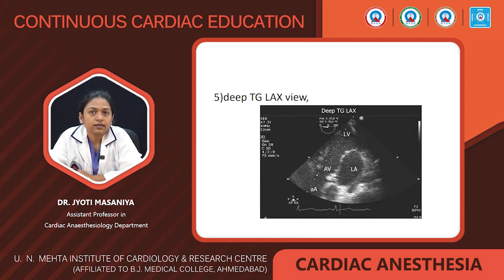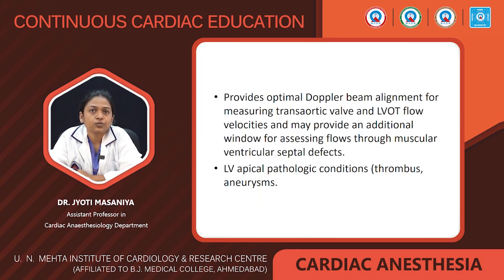The next view is the deep transgastric long-axis view. This view is obtained by advancing the probe deep into the stomach and anteflexing the tip to obtain the view at 0 to 20 degrees. This view is important because it provides optimal Doppler beam alignment for measuring transaortic valve and LVOT flow velocities. It may also provide an additional window for assessing flow through muscular ventricular septal defects, and we can assess LV apical pathology such as LV thrombus or LV aneurysm.